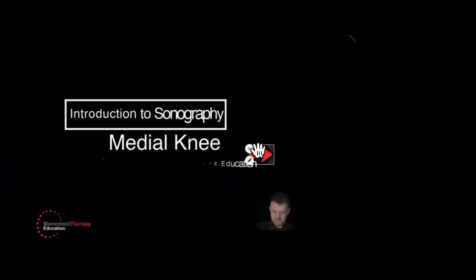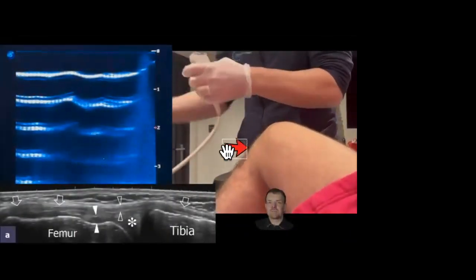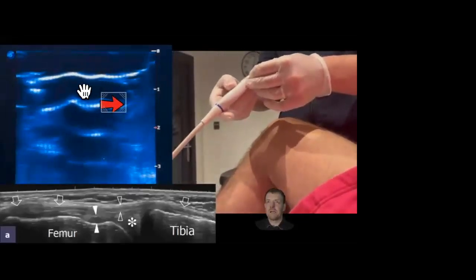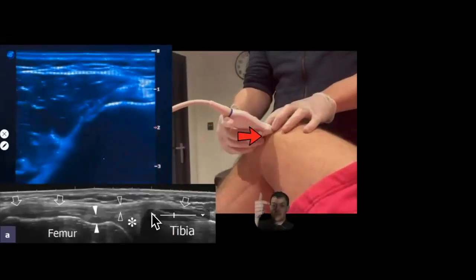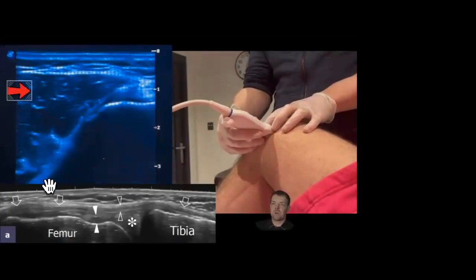Okay, last one is the medial knee. This is a slightly older knee. This is my son's. So we're looking at early 20s, still quite a young one. So looking at the medial knee here, you palpate the joint line. And again, I'm just pressing the end of the probe to check which bit's which. So I'm trying to line up my probe with the screen. So I've got this end here in line with the S. Okay, so I know which way I'm going.